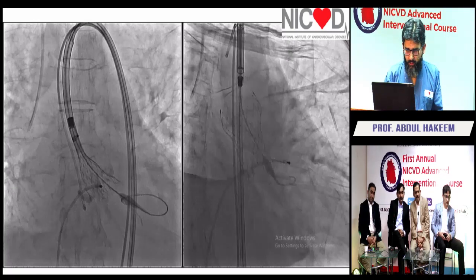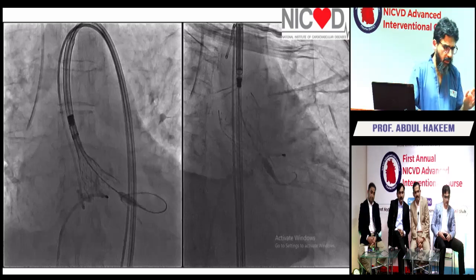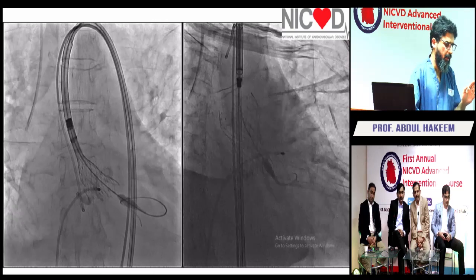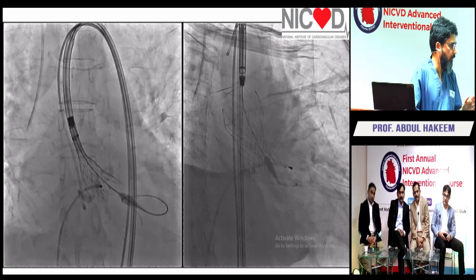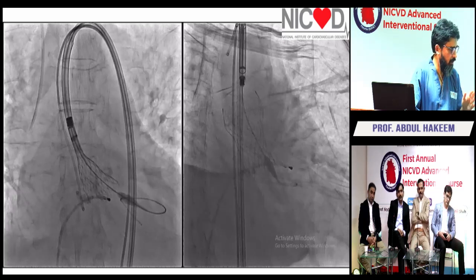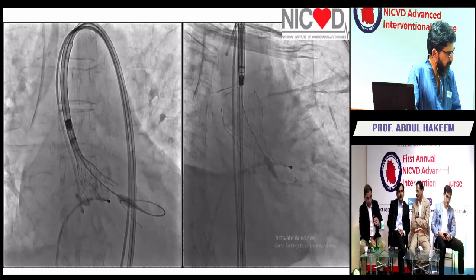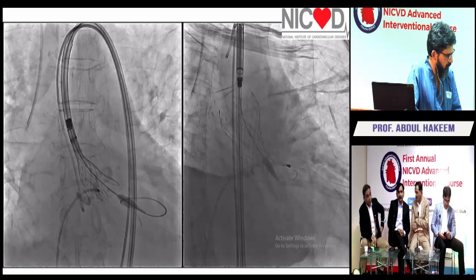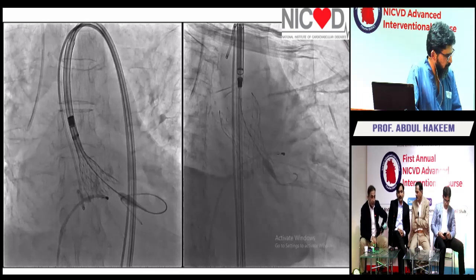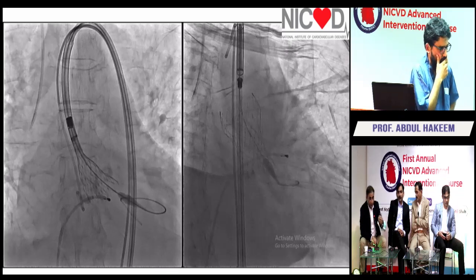Naeem, why don't you just tell us briefly your thoughts on whether we should deploy in the coplanar view or the cusp overlap view, and just tell our audience what the difference is. Thank you. Especially if there's a patient with a tricuspid valve, the cusp overlap view.